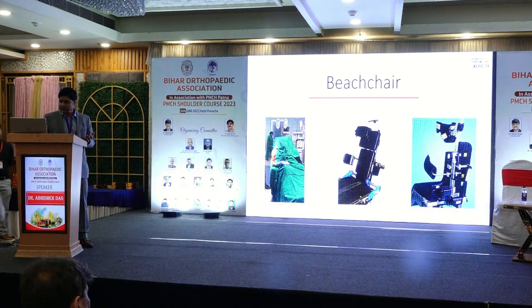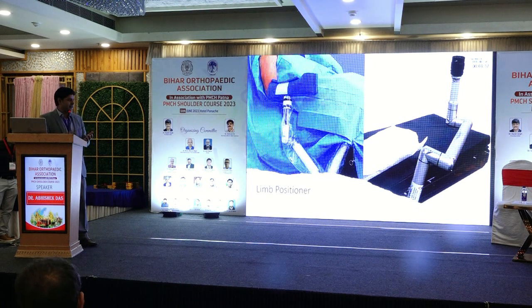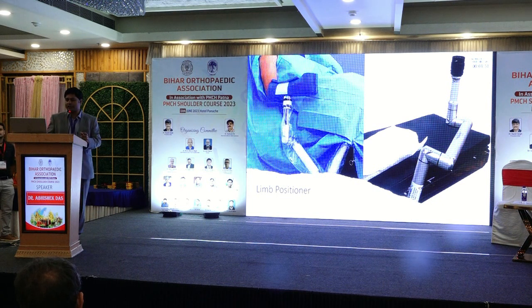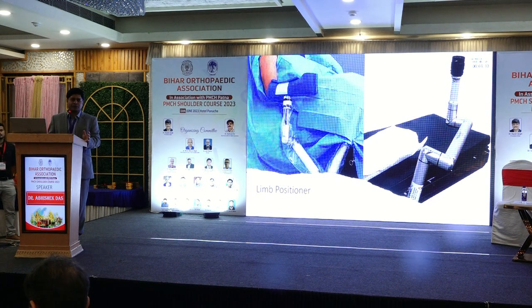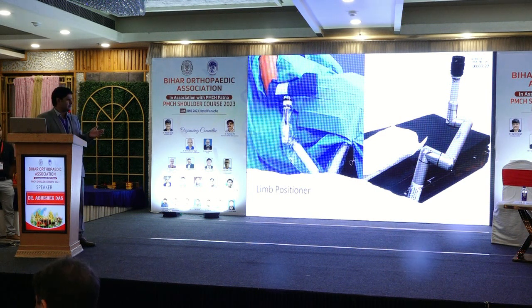Now, if you have the luxury, then you can have this gadget, which is a glorified 10 lakh assistant. This is the Trimano, which is a hydraulic arm positioner, which can hold the hand in any position you like. Again, I do not have this, but I have two assistants who can do the job of Trimano very well. The only problem is they get tired, and if you ask them to hold in 30 degrees of abduction, after 5 minutes, it will be in neutral position. So these are the problems, but as a thinking surgeon, as a surgeon who wants to do things his way, you have to design and devise the methods to suit your needs.